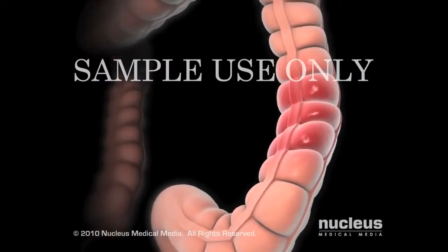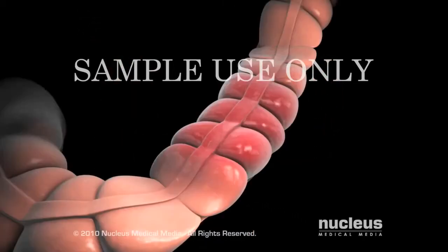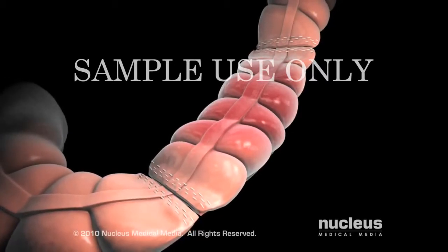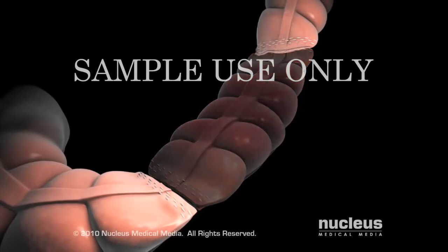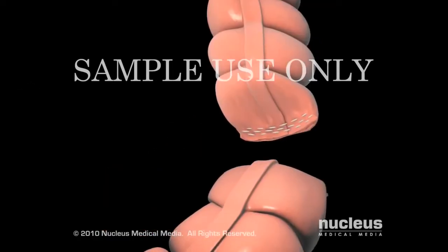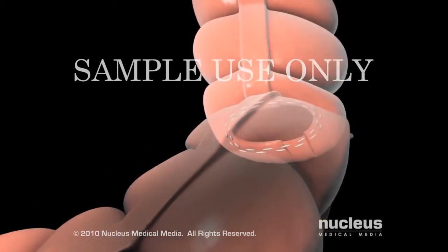Your surgeon will clamp your colon in two places, on each side of the section to be removed. He or she will cut through the colon at each clamp and remove the diseased portion in between, along with a margin of healthy colon and surrounding tissue. Finally, your surgeon will sew the two loose ends of the colon together.